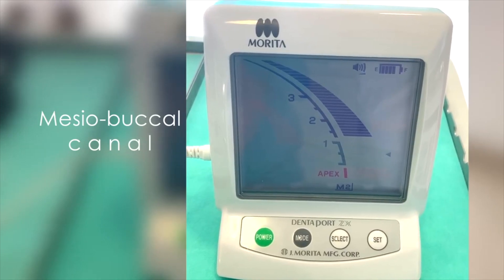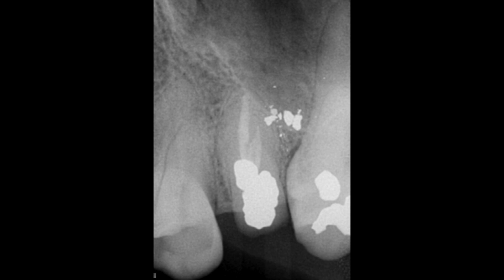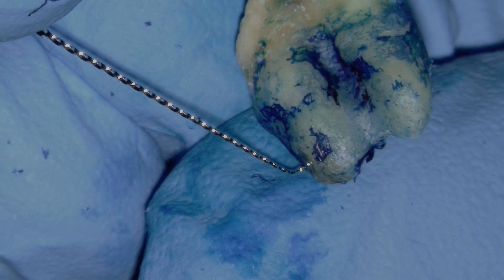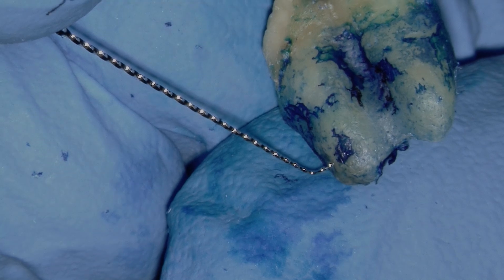Dr. Bakuchi has been kind enough to provide me permission to use his initial video, and he's actually suggested that we continue with this investigation. Let's compare where our file is relative to the apex locator on a radiograph, and what does it look like under the microscope?